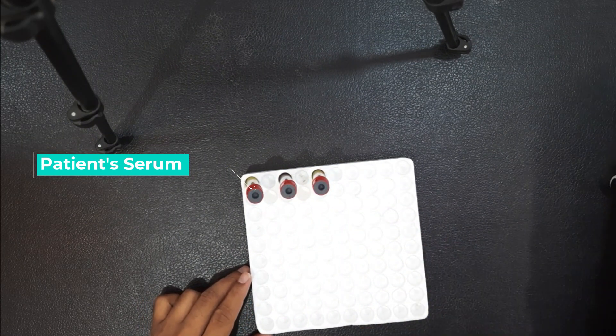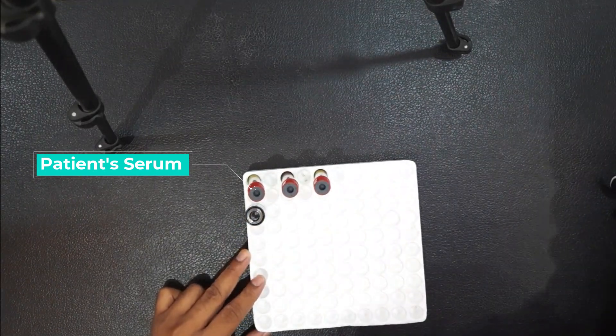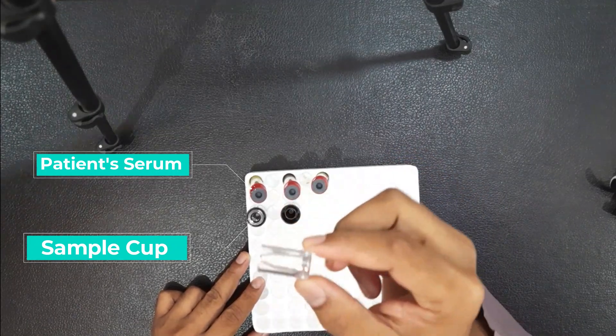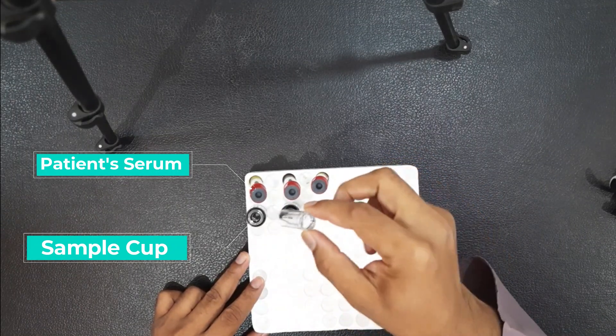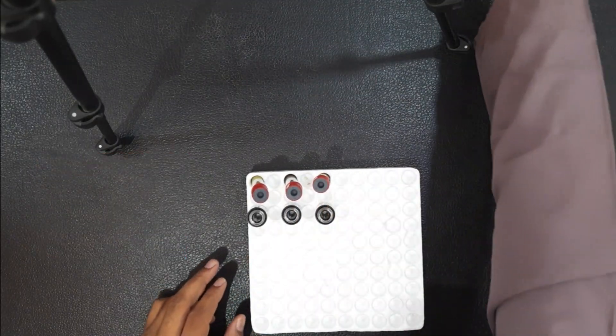Serum is obtained after centrifuging the patient's venous blood in a non-EDTA tube. Here we collected serum from three distinct patients, and in front of each we set a sample cup that would later be placed in an analyzer machine.